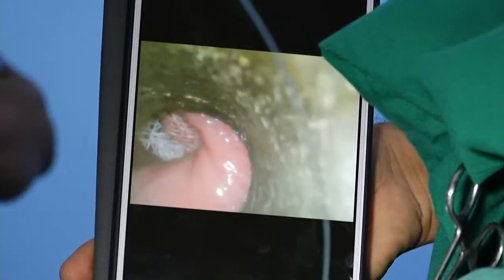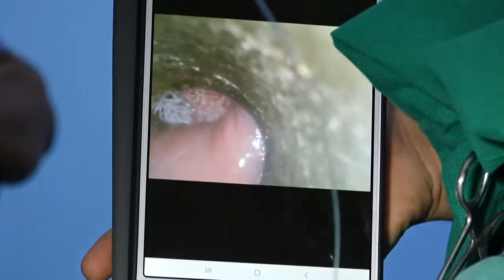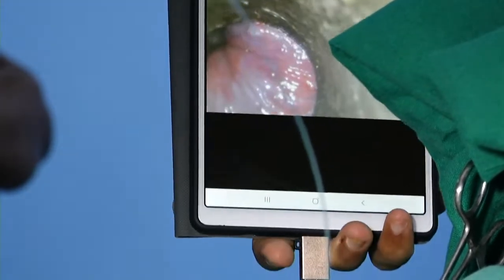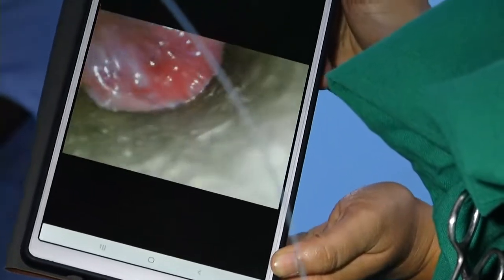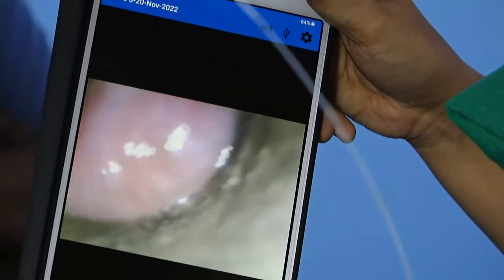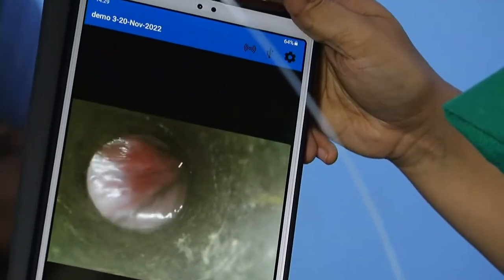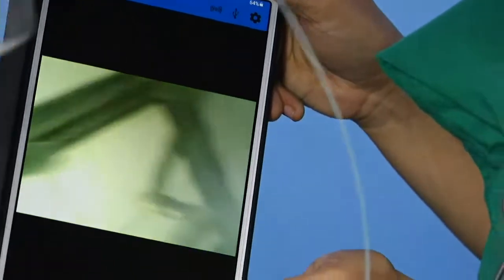Sir, I'm ready. Okay. Rectal mucosa and rectum. The vertical columns of Morgagni, you can see that. See that? This is the beauty of this endoscope. Yeah, this is grade 2 at 3 o'clock, and this is at 6 o'clock, 6 or 7. And one bigger one, a chunk, is at 11 o'clock, and this is grade 3. So basically you can record with this device. This is the benefit of this device.